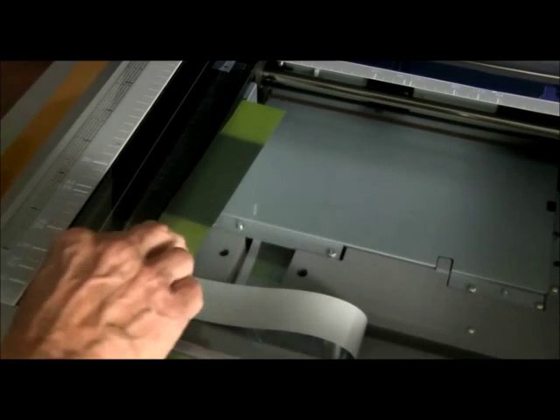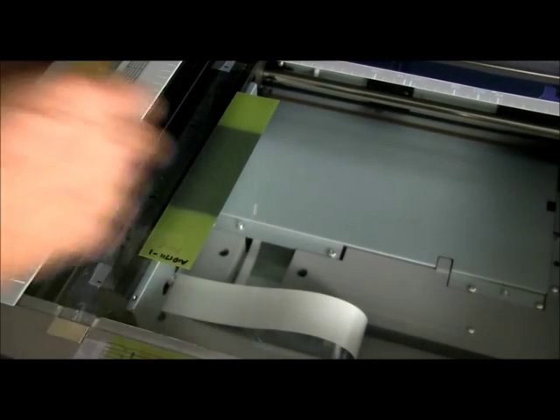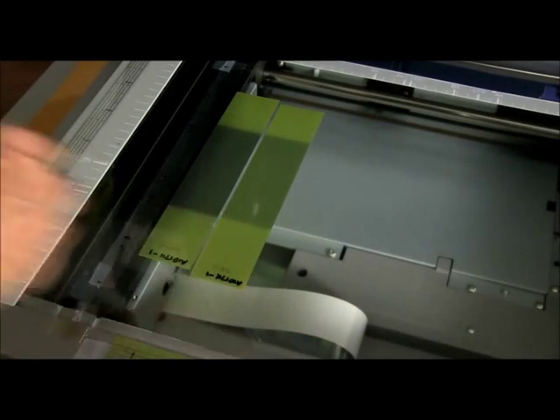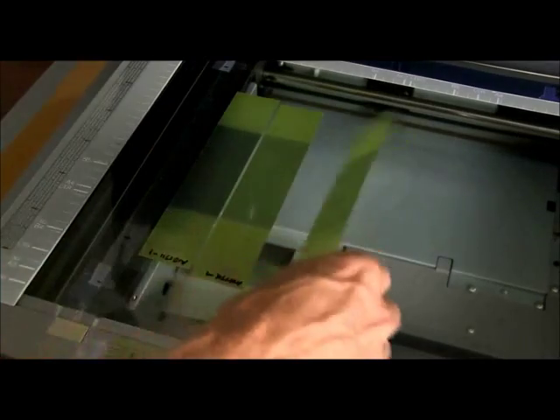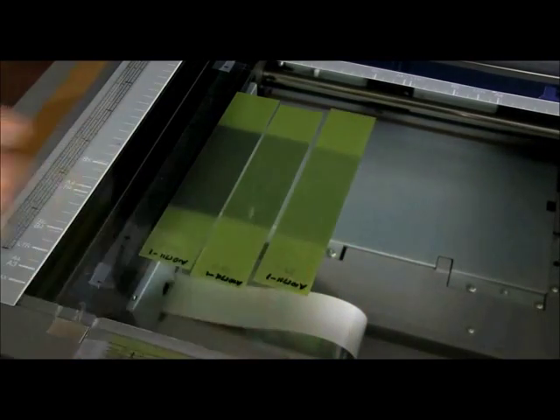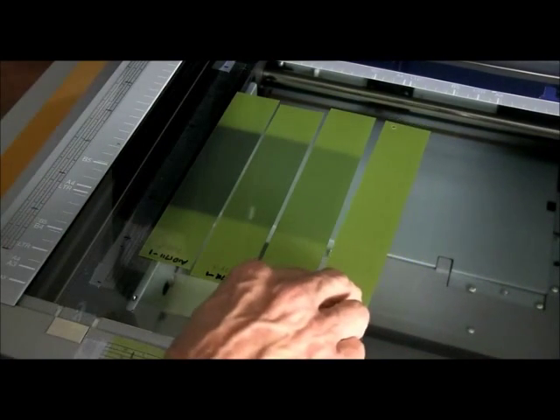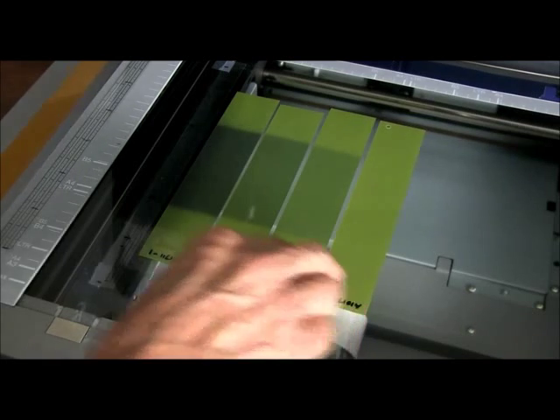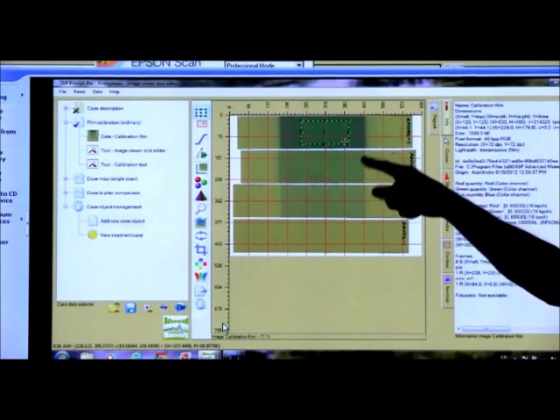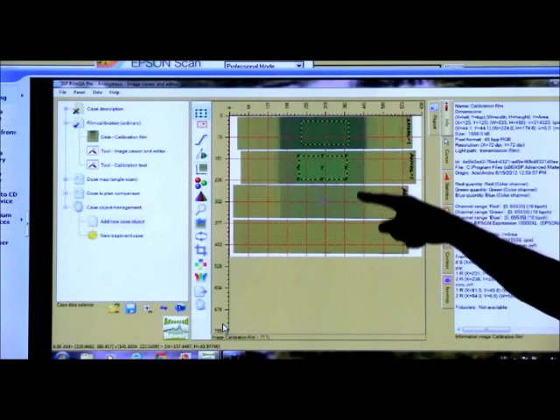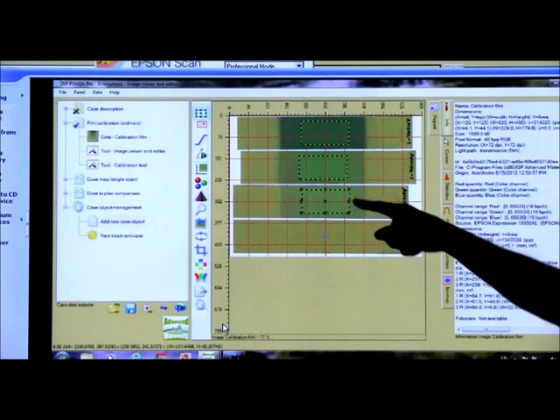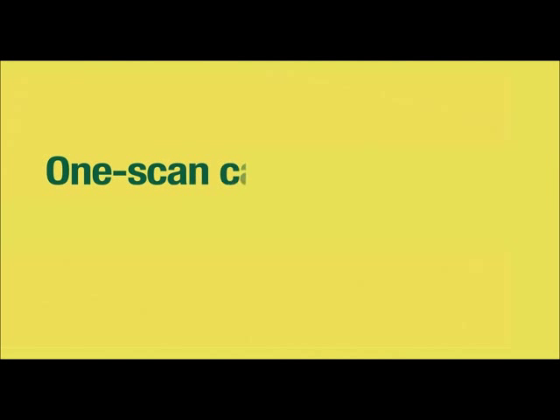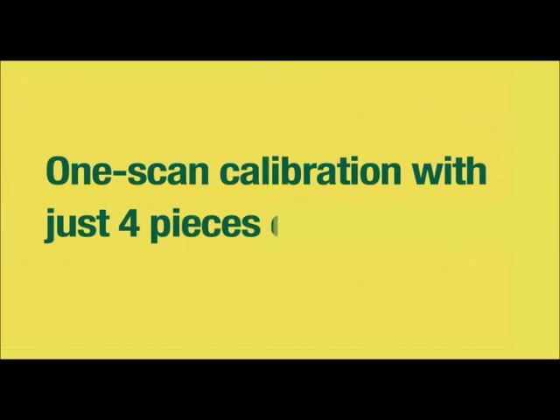Let's start one-scan calibration by measuring the films. As you know, the center of the scanner is the optimum place for film because it minimizes the lateral placement artifact. And as usual, you choose where to measure by drawing areas of interest in the exposed areas. But here's what's new. You can do one-scan calibration with just four pieces of film.